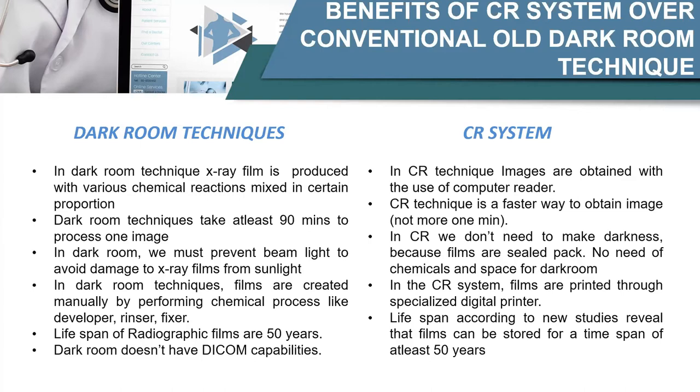Here in CR system, we don't use that. It happens on the computer, so it consumes very less time. Lifespan of both the techniques, after developing, the image remains intact for at least 50 years. I mean, we can see that image quite clearly after 50 years also.